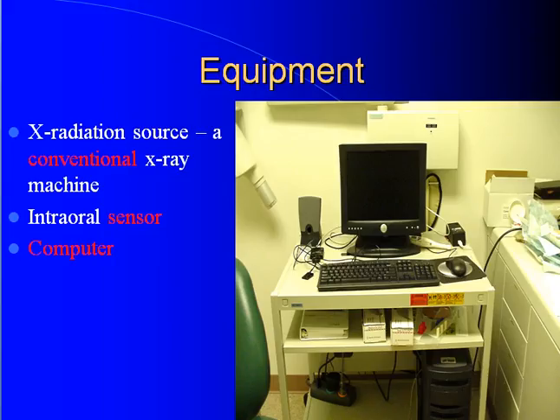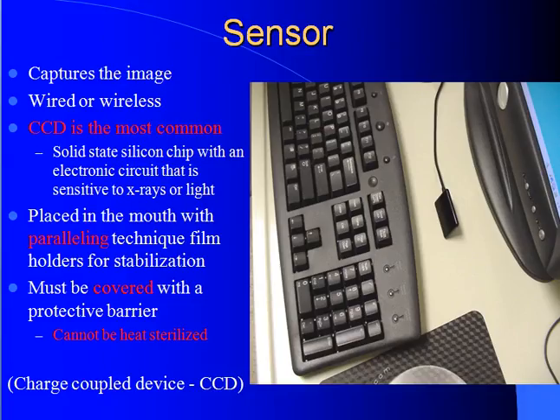In order to take digital X-rays, an X-radiation source, such as a conventional X-ray machine, is needed. You will also need an intraoral sensor and a computer. The sensor captures the images, and they can be wired or wireless.